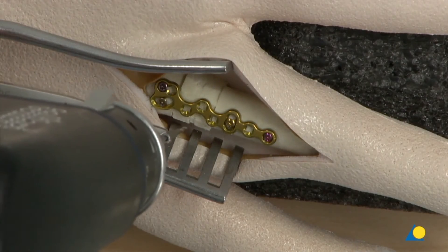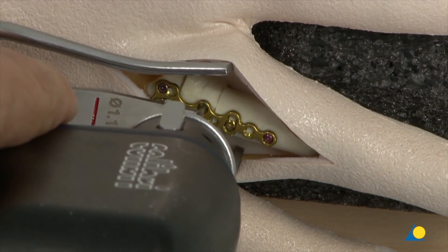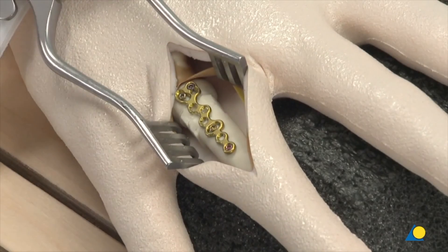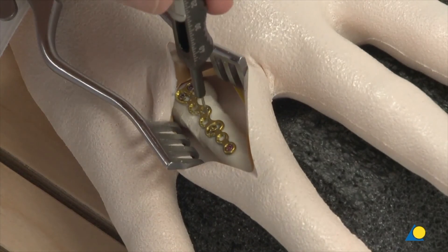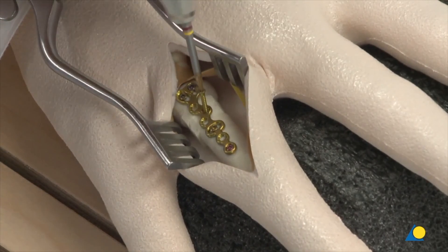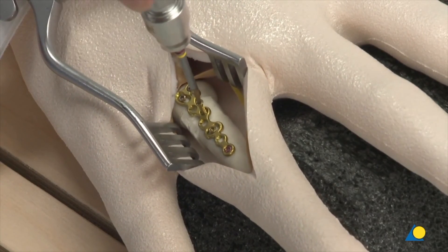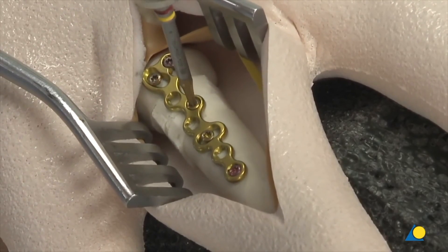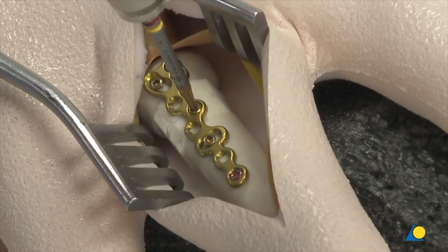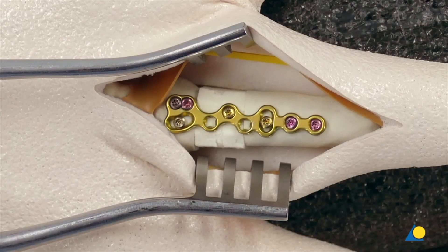The graft will be fixed to the plate with a cortex screw in the usual manner. The fixation is completed with the insertion of two more locking screws: one into the plate head hole and the other into the plate shaft hole.